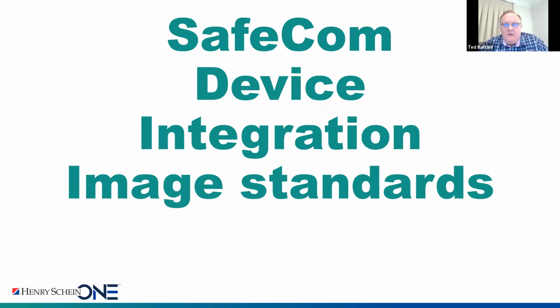What is the risk with that? If you do not use standards, but you use a proprietary communication between the hardware and the software, the 2D imaging softwares from different third-party vendors that do not have a hardware of their own, they're not needing approvals from Health Canada for their imaging part. So to take an example, if you have Sirona with Sidexis software, Sirona needs to get that approval for all their devices for their imaging software, but not for another device of a different manufacturer on their software.